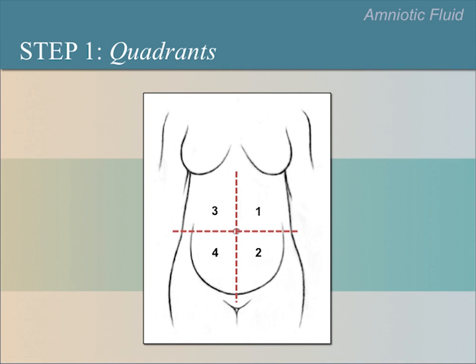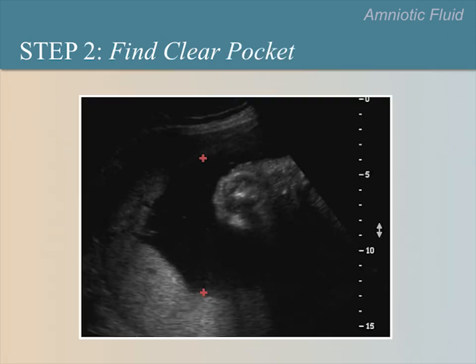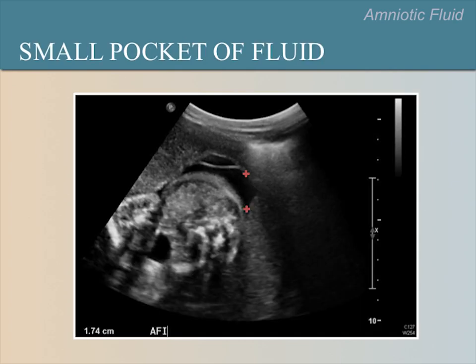The first step in measuring the AFI is to visually divide the uterus into four quadrants in your mind. Next, identify the deepest pocket of fluid in each quadrant that does not contain cord or fetal parts — this should be a solid black area on ultrasound. Notice that if we connect the calipers with a line, the line is straight up and down or vertical. This is a cross-section of the abdomen with just a small pocket of fluid labeled with red calipers.